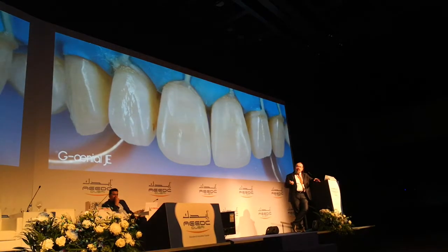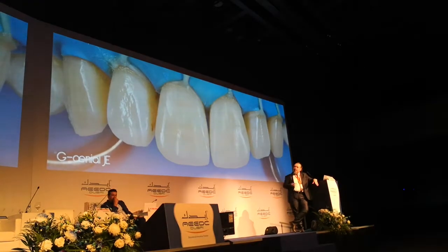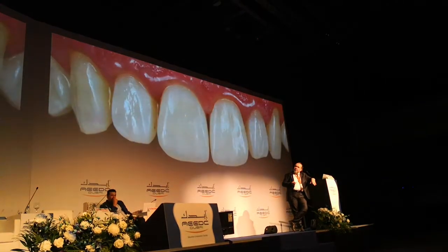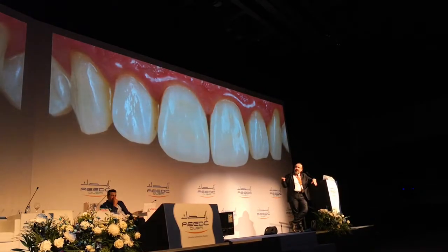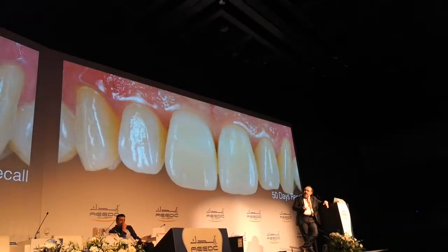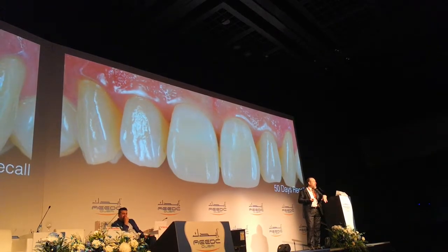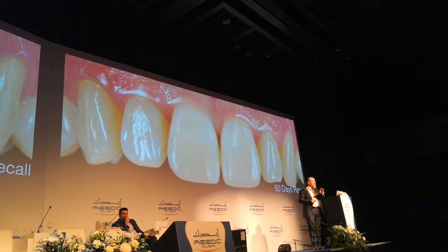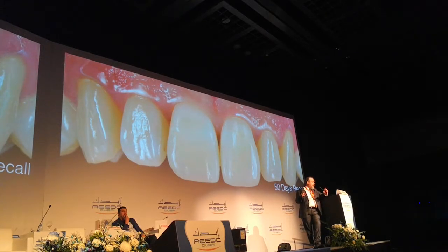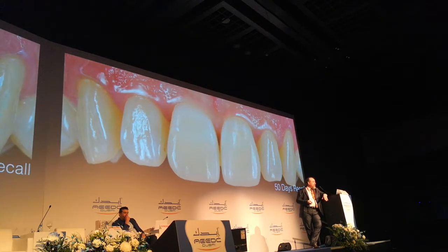So this is after the final layer with the enamel and with some small polishing. And when I remove the rubber dam you see that because of dehydration it looks quite well — we need to see it in the following days, maybe 3 or 4 days later. And this is 50 days ago. I didn't like the result so I need to do some modifications. You remember the strawberry picture? When you add some texture here, especially on the 1.1.